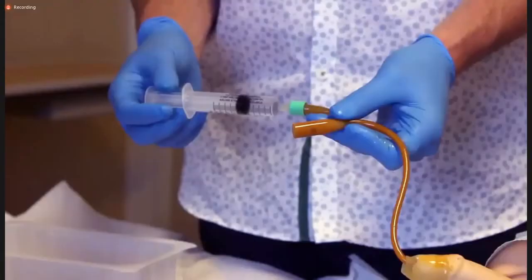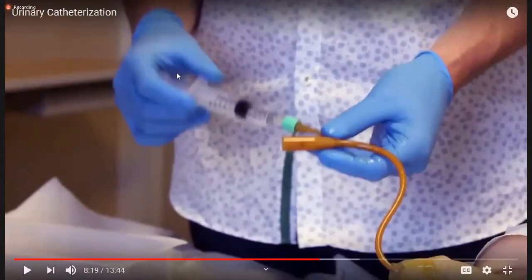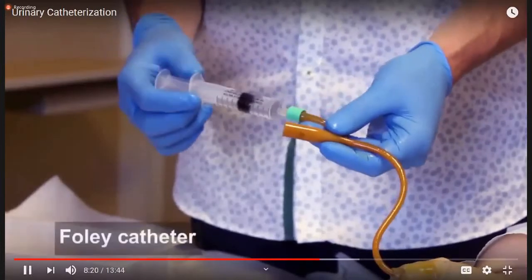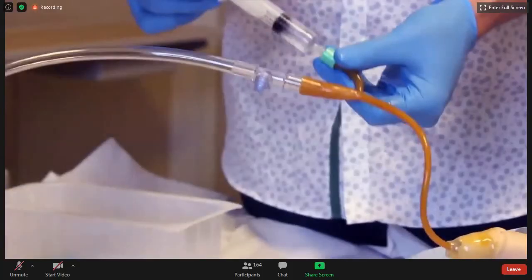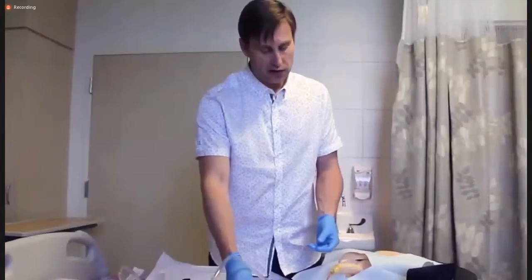There are different types of catheters that we have available. In this case, the catheter that we inserted is commonly called a two-way catheter. Inflated balloon, and another one is attached to the urine drainage bag. Foley catheter. This one, just to review, has a drainage port that again you'll hook your catheter bag up to, and the other port, the second port, is to inflate the catheter balloon.